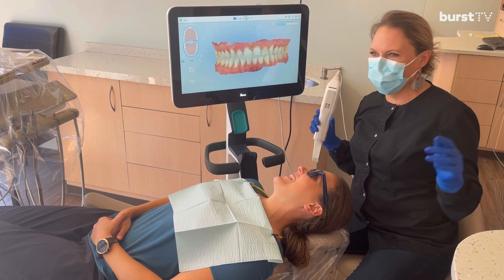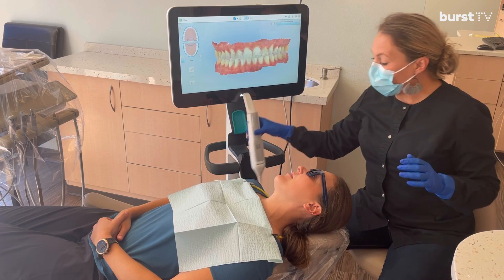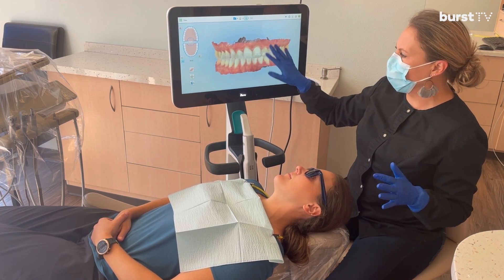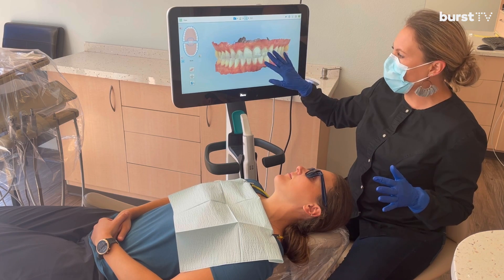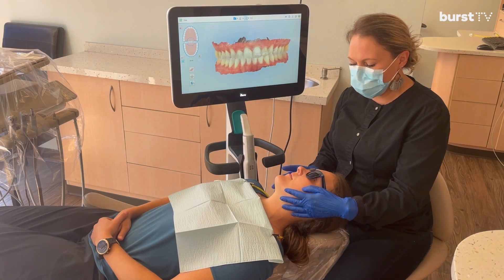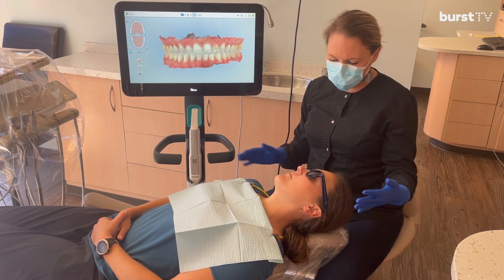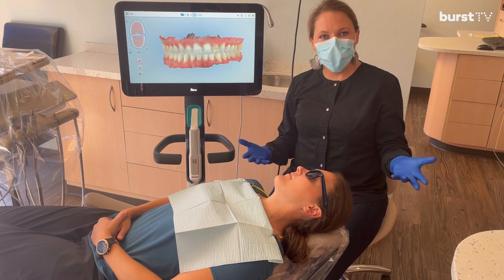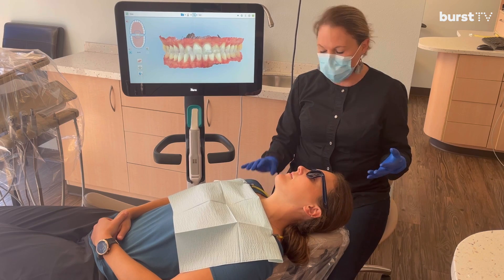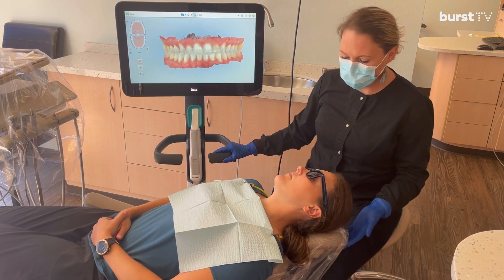It's given me a timer — it took me three minutes and 53 seconds. That seems way long! I usually do this in about two and a half minutes, but maybe the talking. I love to do this at the very beginning of the hygiene appointment because, as you can tell, it takes a while to analyze. Generally, I seat the patient back, take my scan, press that and set it to the side, start my hygiene appointment, and then once I'm pretty much done with everything hygiene-wise, I go back, seat the patient up, and we talk about the scan.